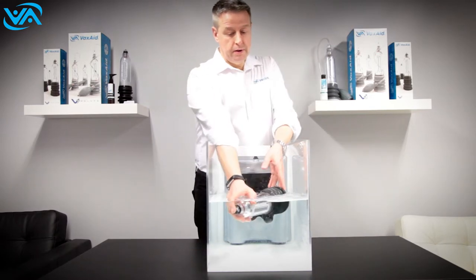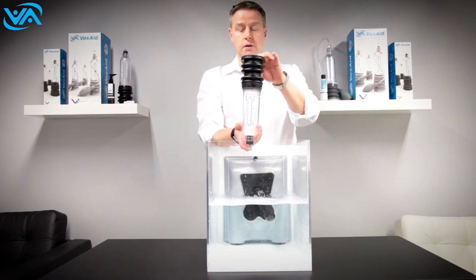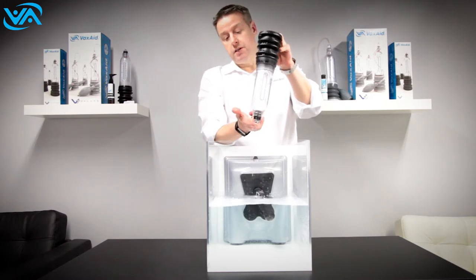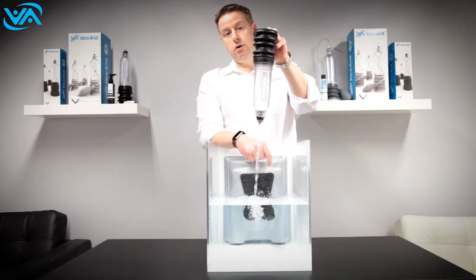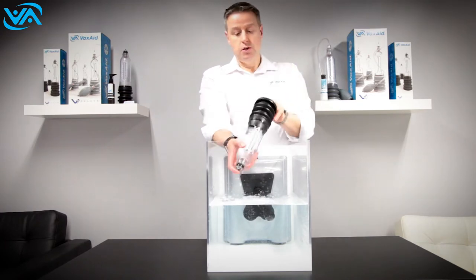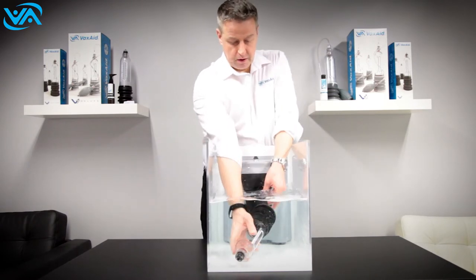In either the bath or the shower, simply fill the pump with water. When filling it in the shower, it's important to keep your finger over the black pit — if you don't, all the water runs out.